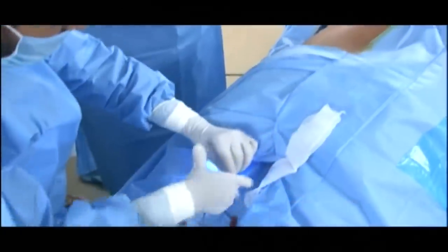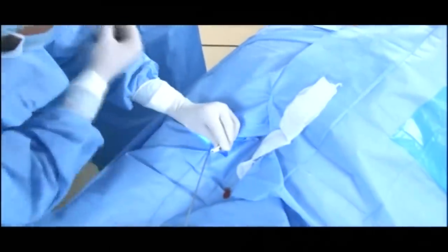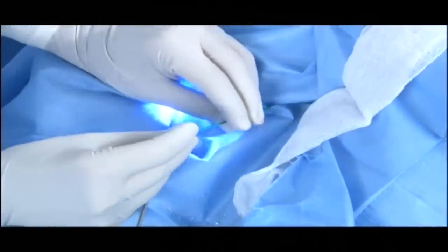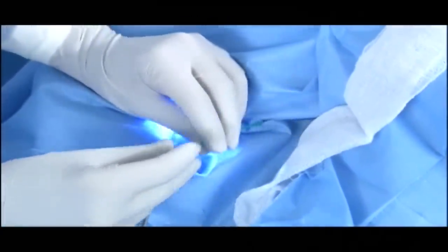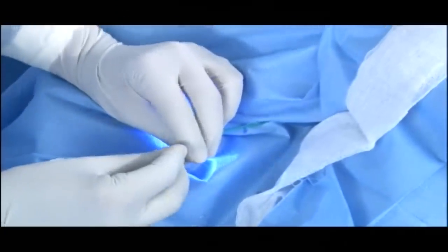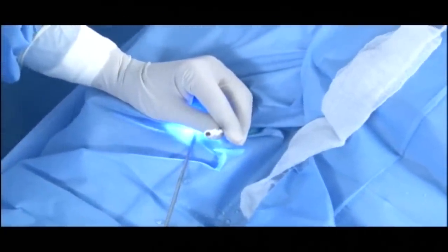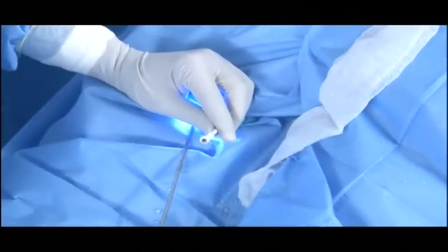Dr. Kukreja, this is Dr. Jagdish here. Good morning. Do you have any special method for manipulating the guide wire for this sort of stone case? I will use a Terumo glide wire, a straight tip, because that is the only one which will go across. I want to get a secure wire across — that is the main crux here.